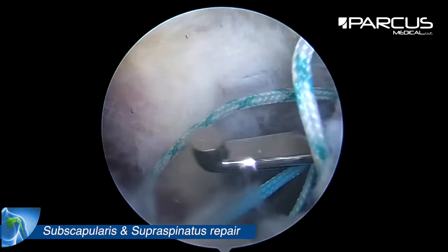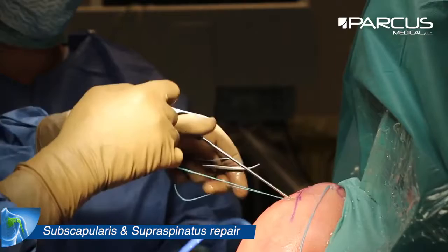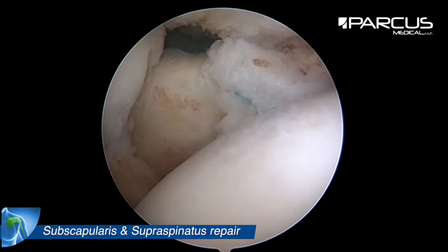Then we retrieve the sutures and we tie the knots. We check the repair.